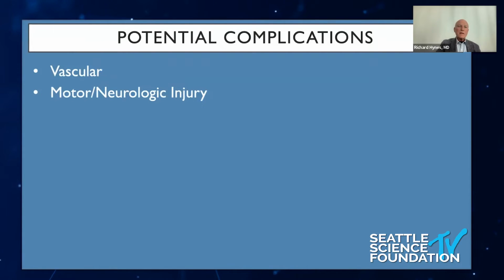And so I think there's a slight advantage there from the neurological side at L4-5. But we can have it, and it can happen. Urinary injury doesn't happen anymore with the third blade. Before we protected the peritoneum with the initial two blades, we had a couple of urinary injuries, and we realized you've got to put a protective third blade in, and that problem's been solved.